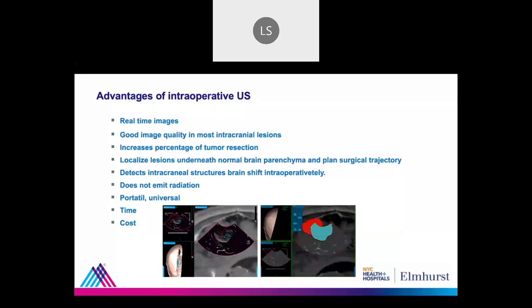Resections. When you inspect the resection cavity with the ultrasound, once you gain sterility with the ultrasound, you can see a residual tumor, and you can go for that if it's functionally resectable. Then you can also use it to plan your trajectory when the lesion is underneath healthy brain.